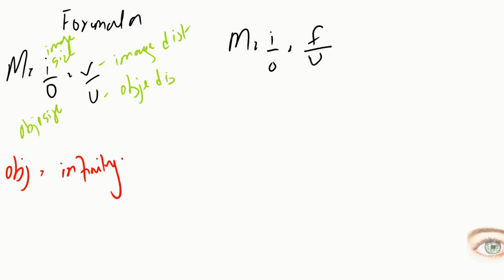Now, some of you may ask that if I'm talking about the object, then why am I placing the focal length at the position of the image? Because in keratometry, we are taking the image as the object, right? This first Purkinje image is going to act as an object, right? Now, we know that the focal length F is half of the radius, sorry, right? Now, we are going to make it even simpler for you.